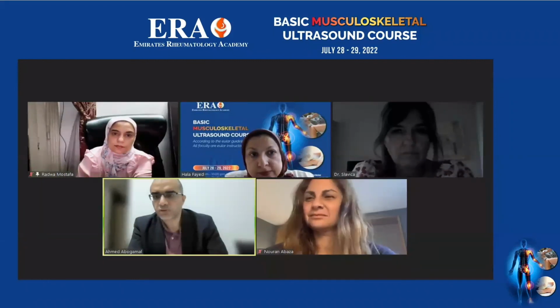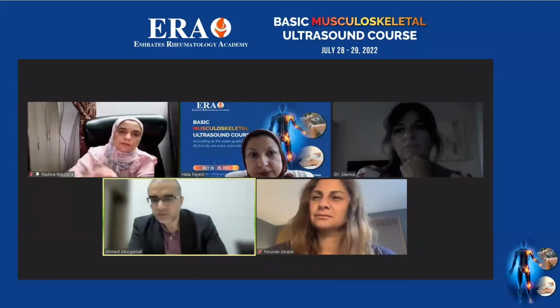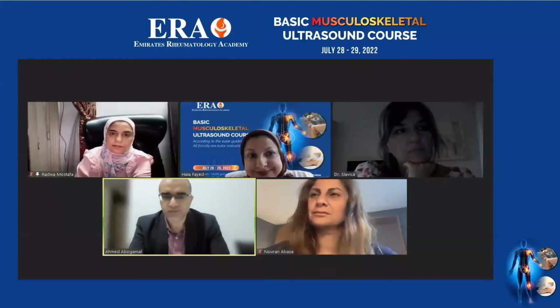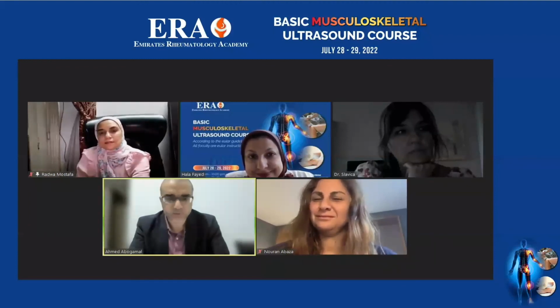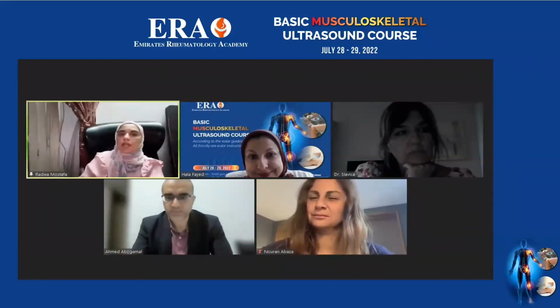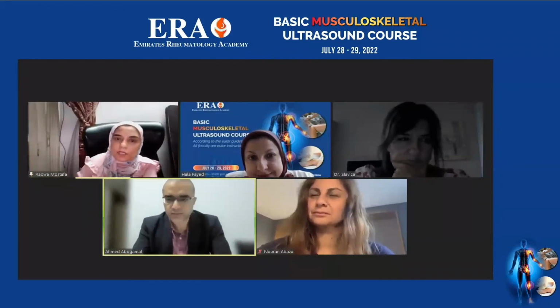Following the questions here: can we differentiate mechanical from inflammatory enthesitis in ultrasound? This is the everyday question. I answered yesterday, so I proceed with this and answer Radwa. You can answer. How to differentiate between mechanical and inflammatory enthesitis.